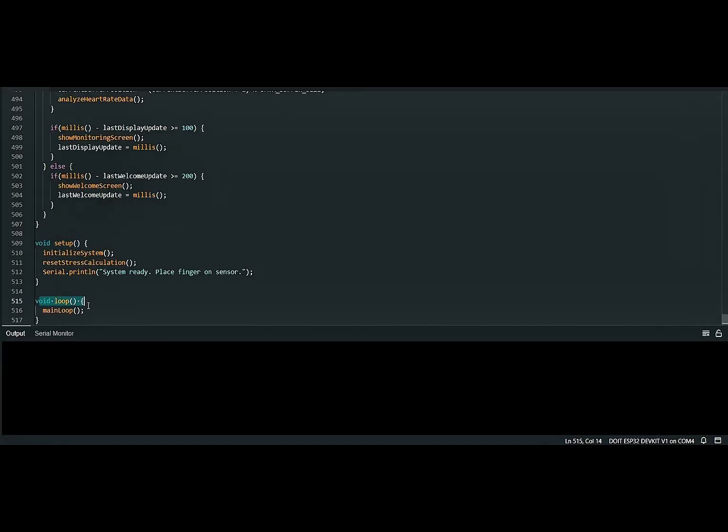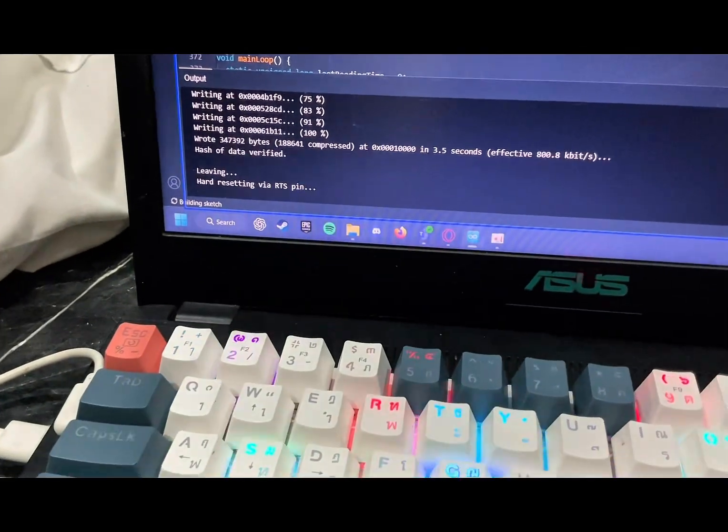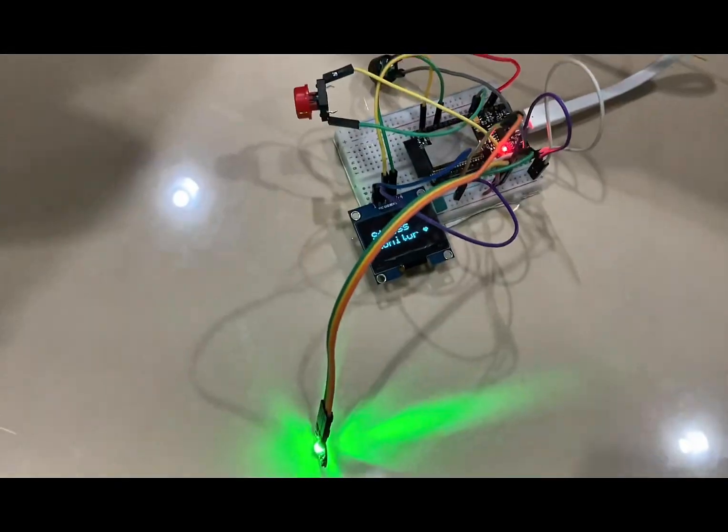Last part is void setup and void loop. So I put the initialize system that I mentioned before in void setup, and in void loop I put the main loop. But in void setup I use the reset stress calculation, so it will reset only one time, because if I put it in the loop, it will reset all the time, so the stress is 0 all the time. Last part is the device test. So we will upload the code and check the device.